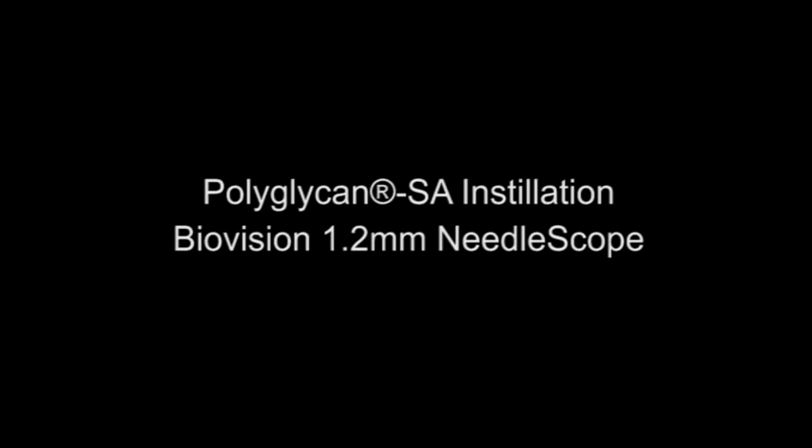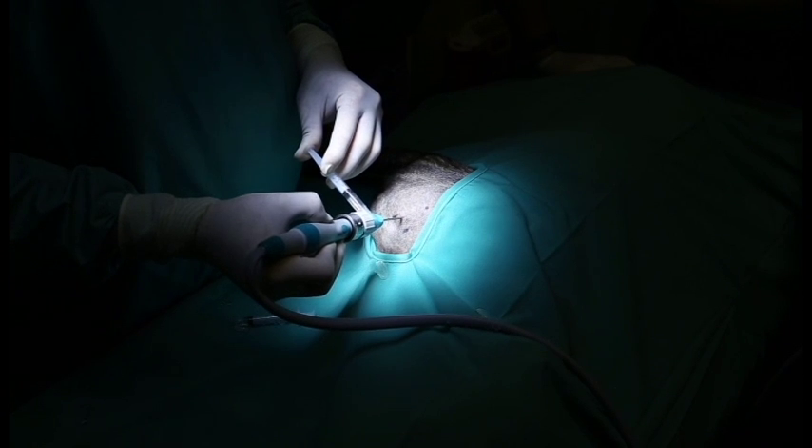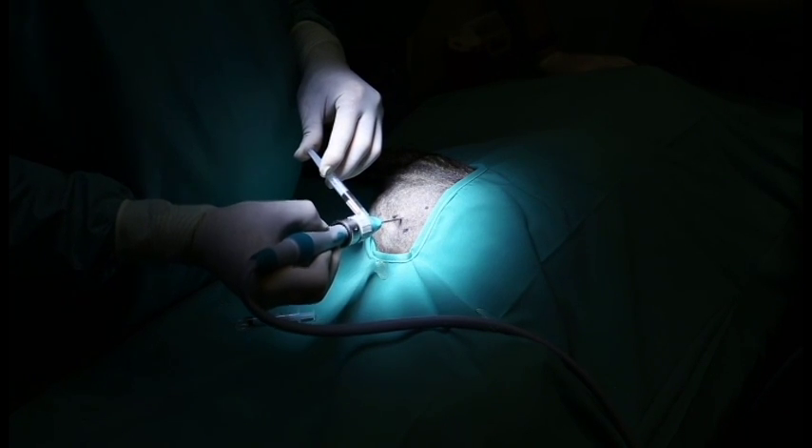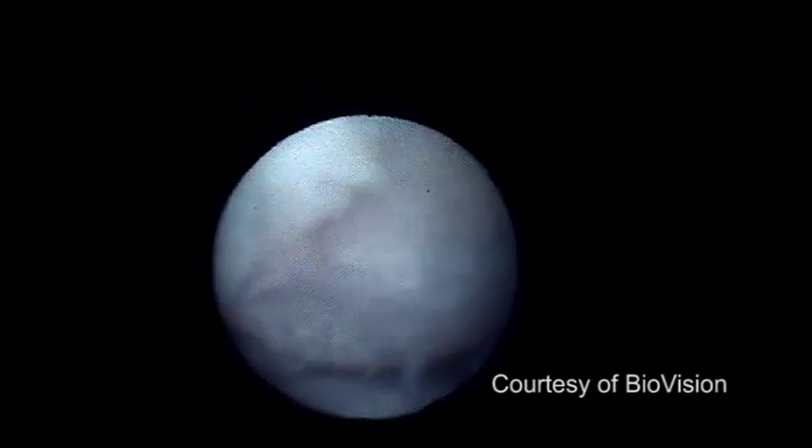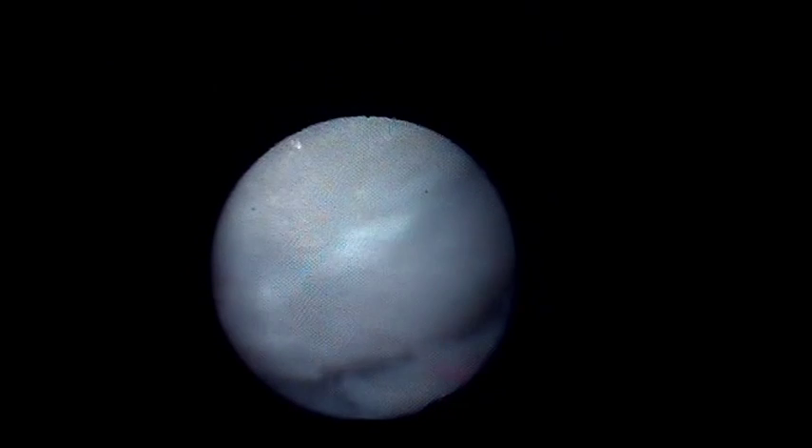Micro-invasive arthroscopy for diagnostic and therapeutic joint procedures is available for use in companion animals. The 1.2-millimeter needle-view arthroscope by BioVision is a breakthrough in technology, providing practitioners more potential expansion into joint therapy with a compact and portable all-digital arthroscopic suite.